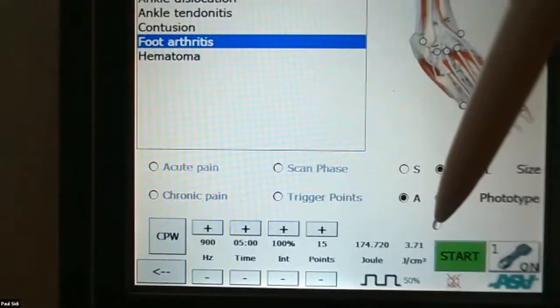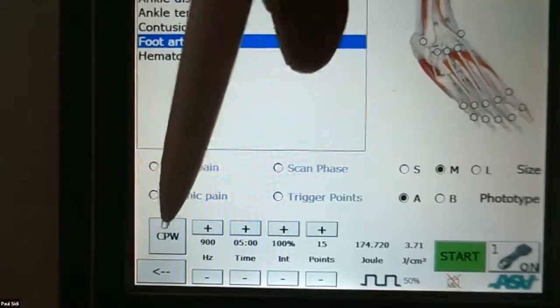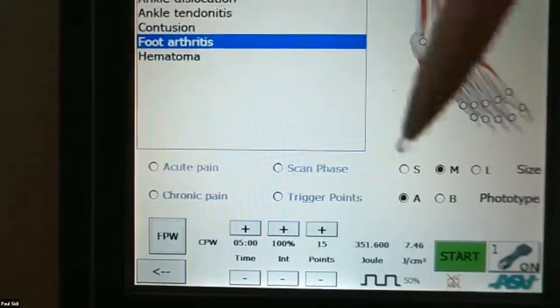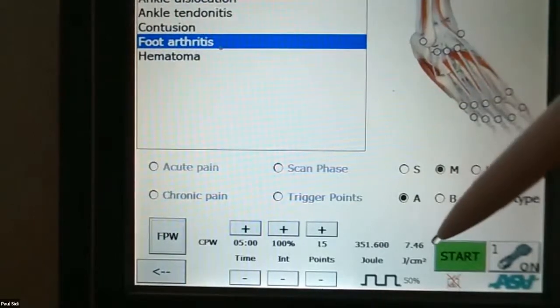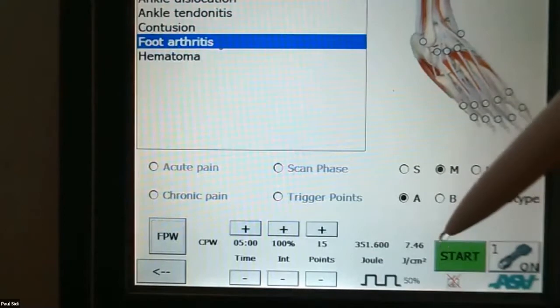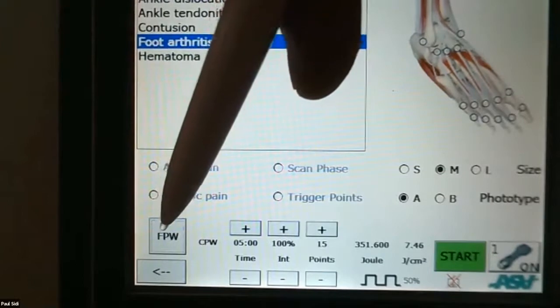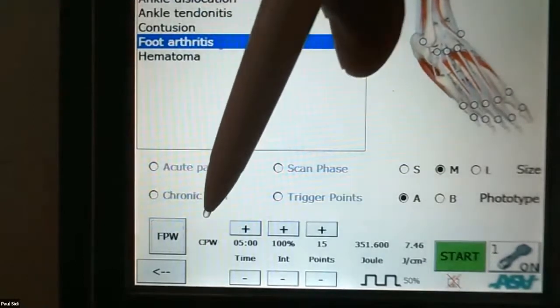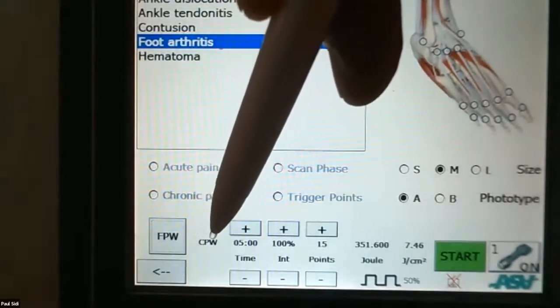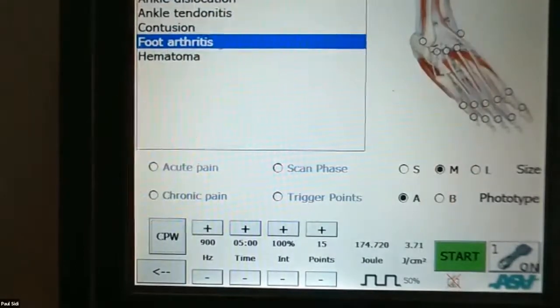I could actually say, look, I tell you what, let's really whack a load of joules in there and just press the CPW. If I press that, you see that's gone straight to 7.46. Just be very careful with this. That's something you could use if you're not getting any results straight away by sticking in a load more power. But what's happening here, I'll explain in a second. We've actually got rid of the frequency wave. Okay, it's now continuous. If we bring that back, the joules come back down to 3.71. What is happening? Let me explain really quickly.